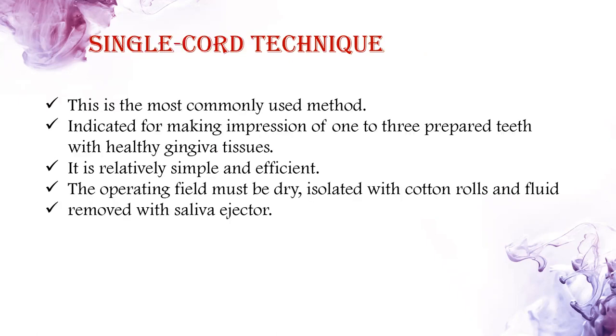Single cord technique. This is the most commonly used method, indicated for impression of 1 to 3 prepared teeth with healthy gingival tissue. It is relatively simple and efficient. The operating field must be dry, isolated with cotton roll, and fluid removed with saliva ejector.